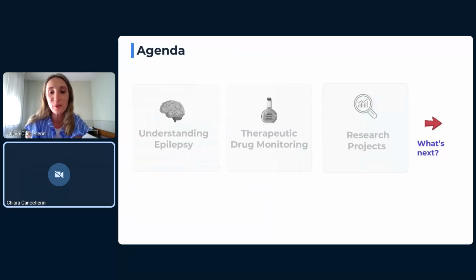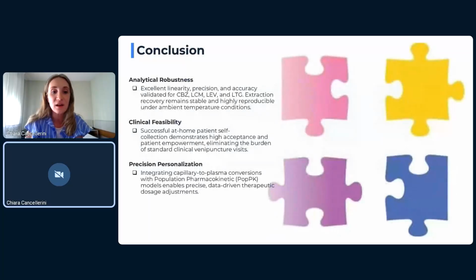So just a bit of hope before leaving. What we did until now was part of a big project, and of course we found some good things, like the excellent linearity and precision for some drugs. The success of at-home patient sampling can also be considered a good result, and the integration of capillary to plasma conversion in the POPPK model can also improve precise, data-driven therapeutic dose adjustment.